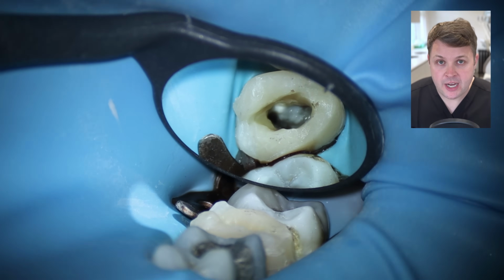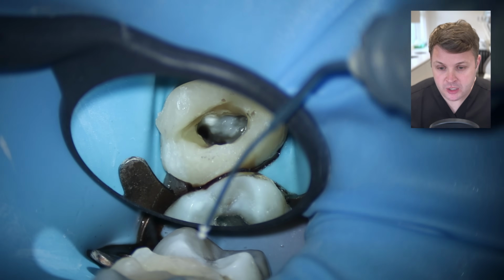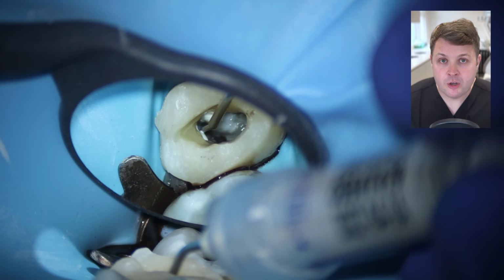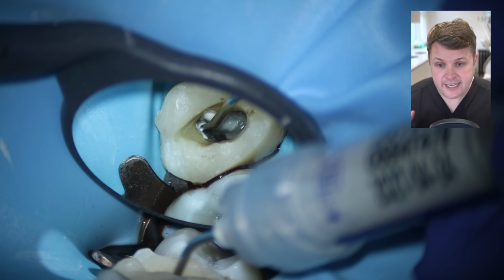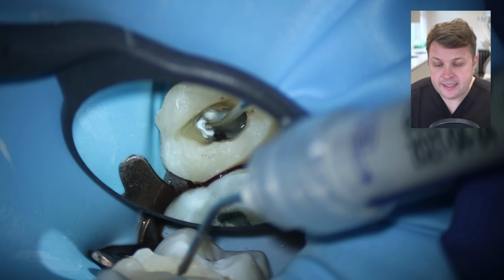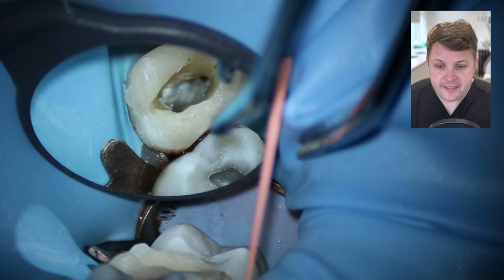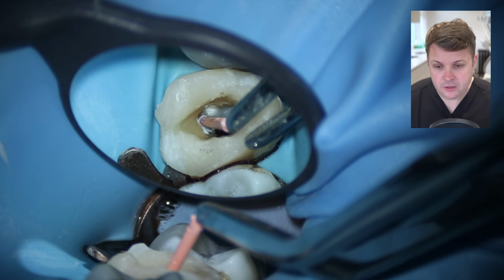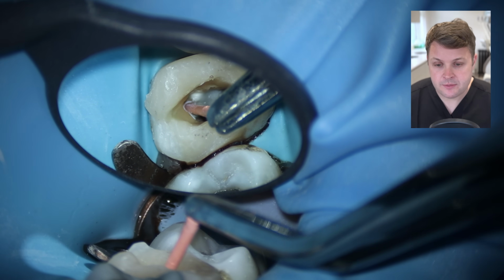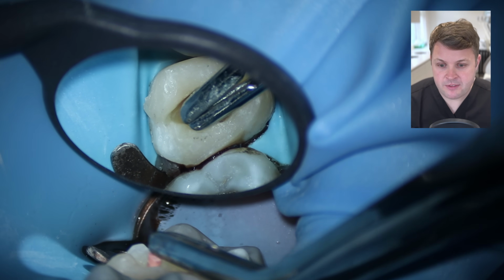I am not going to be shy about this palatal canal. I know it's really, really wide, so I'm going to make sure that I fill this palatal canal from top to bottom, from mid to coronal. Make sure it's all nice and filled, and I'm going to use my glide path file here just to introduce the bioceramic into the full length of the canal. Then I'm going to get my prepared GP cone, the one that's been cleaned with isopropyl alcohol, and push it very, very gently down to length. Make sure that we get that nice, really deep 3D fill.